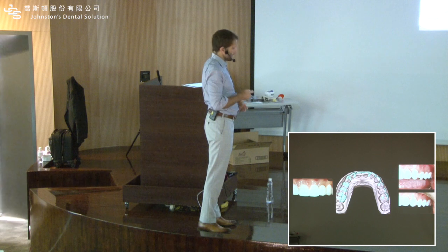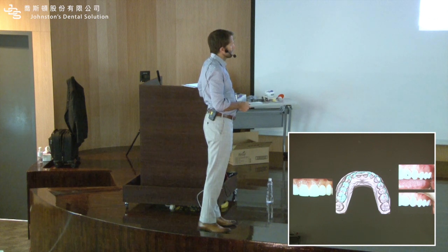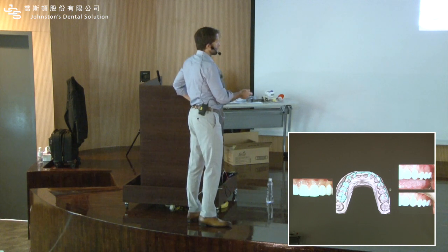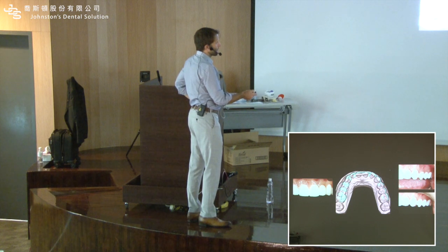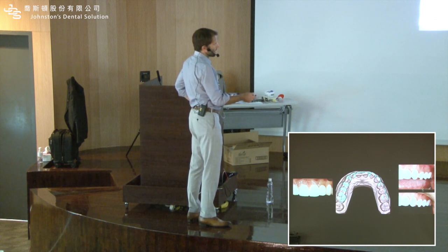A couple of tricks here. What you see here? You see the black here? So always have a black marker ready. Because if the existing teeth are longer than they should, you can use optical illusion here. And when you have black background, look, it disappears and you have the illusion.